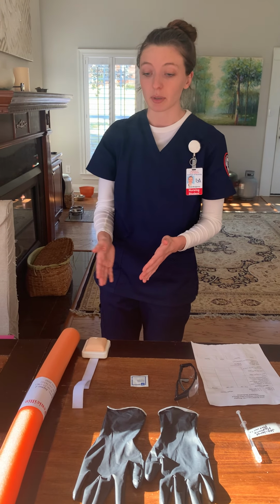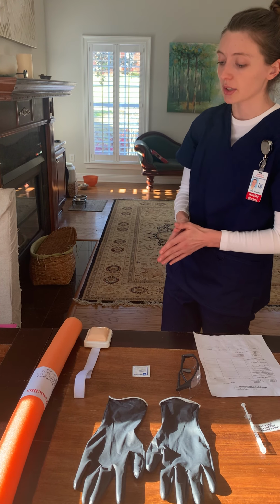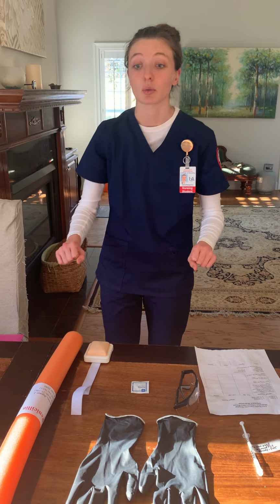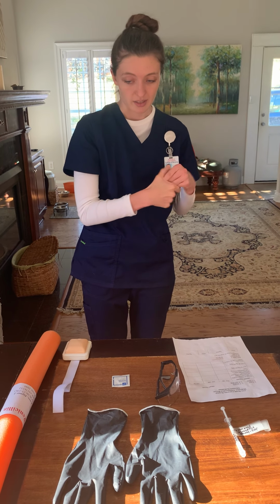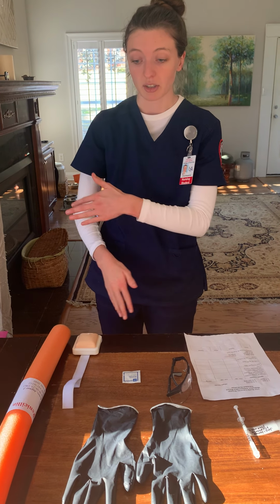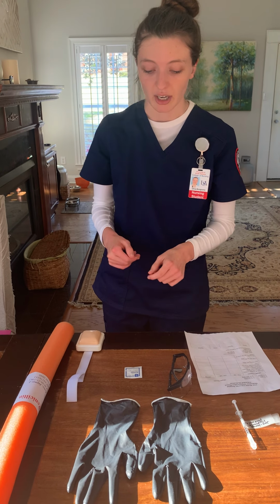All right, Mr. Jones, I will be injecting you with heparin. I am going to now raise the bed to a working height. I am going to drop the rails. I'm going to now sanitize my hands again because I just touched my nose. I am going to drop the rails for an easier access to the site and make sure that there's nothing covering the site, of course, before I give the injection.